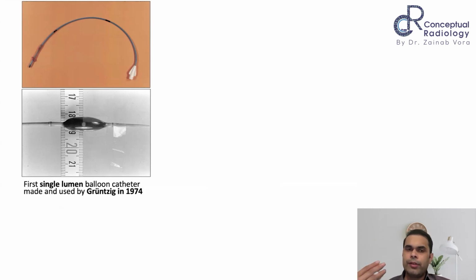When you developed double lumen catheters, you had a separate lumen for the wire and a separate lumen for the contrast filling the balloon. So through the wire lumen you can actually take a run also. We will talk about double lumen catheters, but this is a single lumen catheter. The wire also goes through this only, and the problem was that whatever contrast or anything you injected was going to open up this balloon, and it cannot really go into the artery.